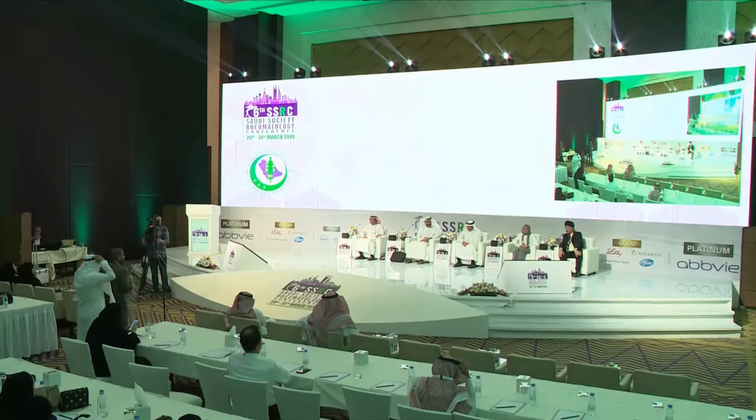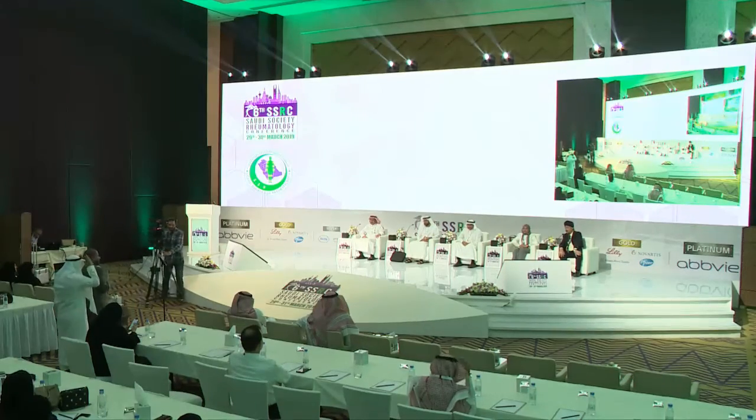Thank you so much for the question. So there are studies that looked at ultrasound use in early scleroderma. So you can actually measure the thickness of skin quite well. With the frequency of the probes now available, you can go up to anywhere from 22 megahertz to 60 megahertz. So the skin is actually of huge interest, not only to us but also to dermatologists for different diseases. But beyond that, I think much more interesting for us is the musculoskeletal system.